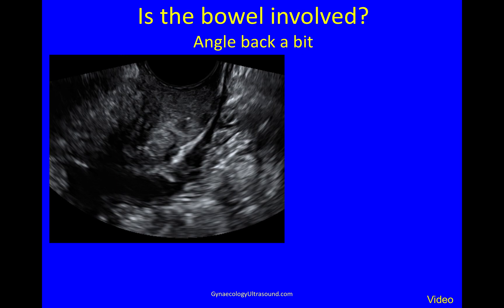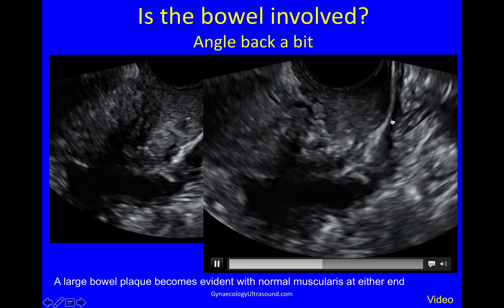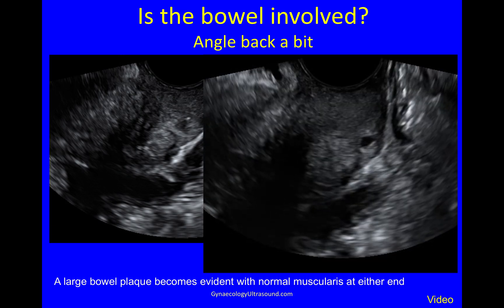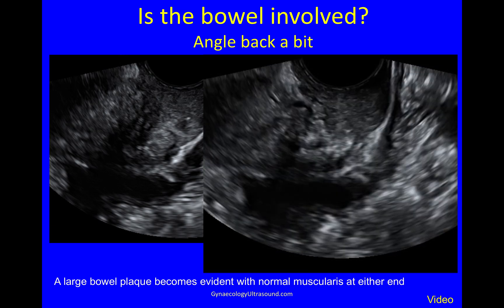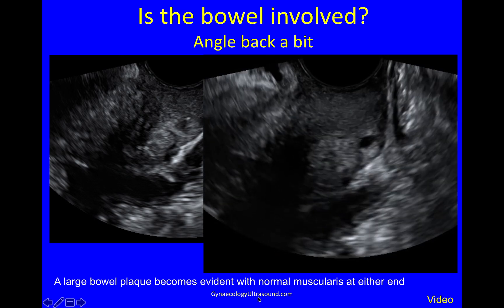So is the bowel involved? To see that we need to angle back a bit, posteriorly. Always stay gentle and remind the patient to let her knees go floppy. When you angle back a bit you can see some normal muscularis layer here, very low down. The dark is the vagina, the white is ligaments, and this is the muscularis layer. It's normal to here, and then you can see that this thickens out — this is abnormal muscularis. If we look at that on a video, you can see normal muscularis there, then it becomes abnormal and all of this is abnormal halfway up to the back of the uterus. We're angling back looking to see how the normal muscularis becomes thick and abnormal, and then at this point we would see it becoming thin and normal again.